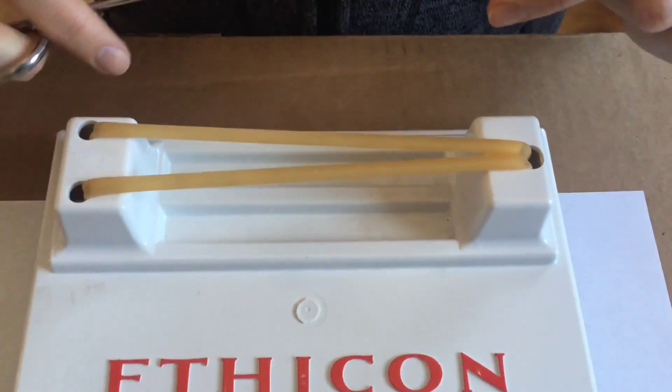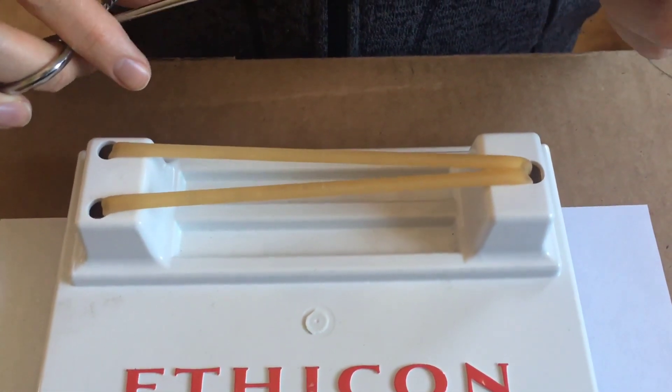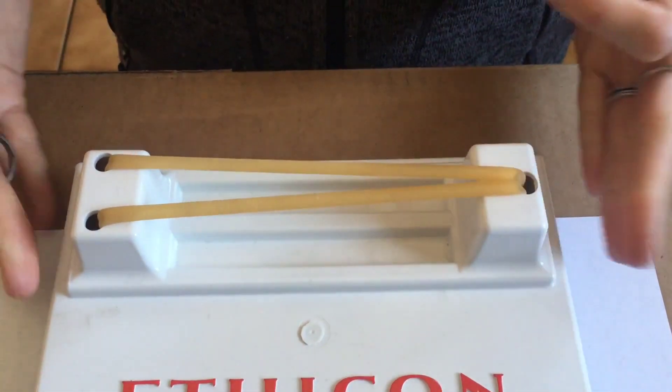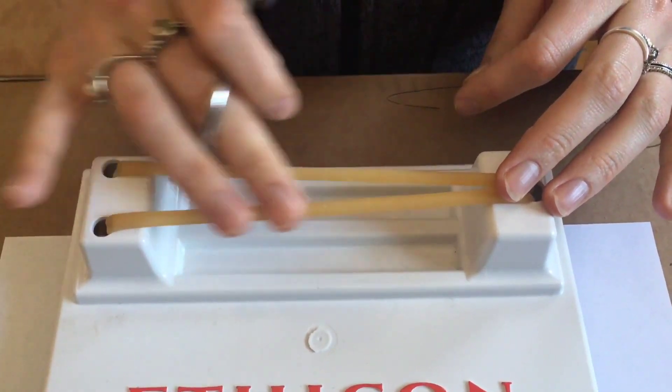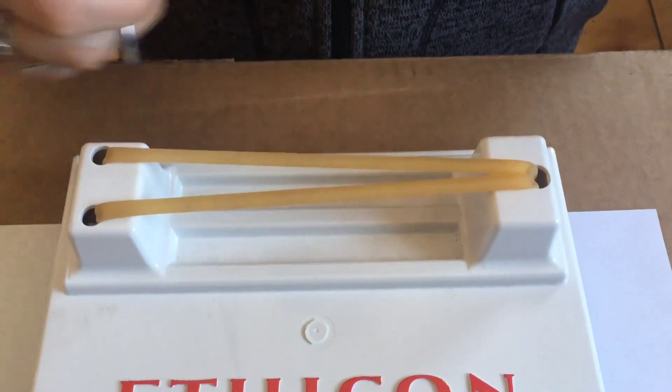Today I will be showing you the modified Miller's knot. You'll be using this in the spay lab to tie off the ovarian pedicles or the uterine stump. I'll be using this practice model to simulate that. You can also use a hairband or a pencil to practice at home.